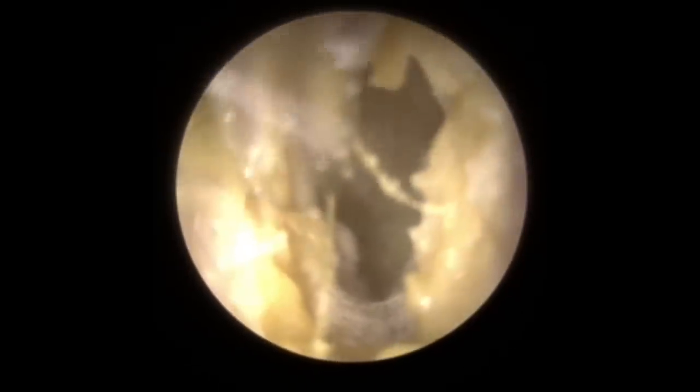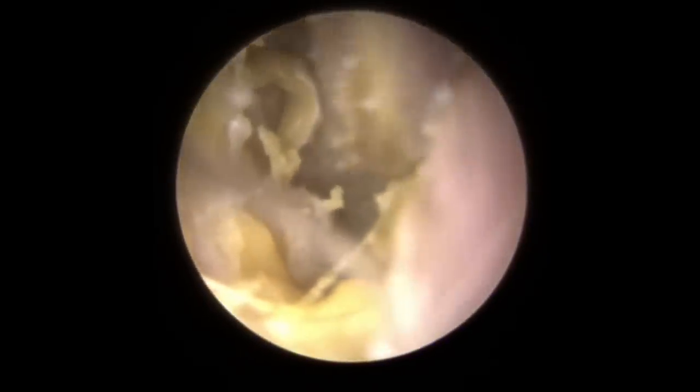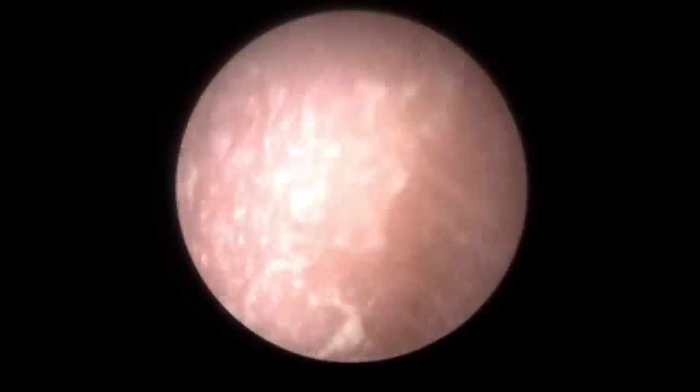You can see it's all coming away here. Can't quite see the eardrum yet, but you'll get a good look as we lift this piece away. See that flap that appears — it peels away quite nicely. The analogy I usually use to describe the texture: if you've ever had the skin on a custard or a gravy, you get a skin on top — it feels that kind of consistency. So you can sometimes lift and peel this down the canal.